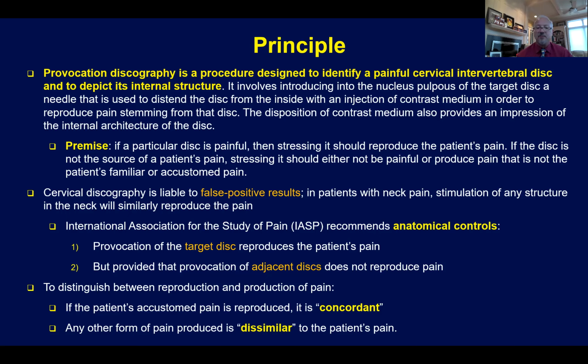If a particular disc is painful, then stressing it should reproduce the patient's pain. If the disc is not the source of the patient's pain, stressing it should either not be painful or produce an atypical pain response. However, cervical discography is liable to false positive results in patients with neck pain, where stimulation of any structure, even the zygapophyseal joints, for example, will similarly reproduce the pain.